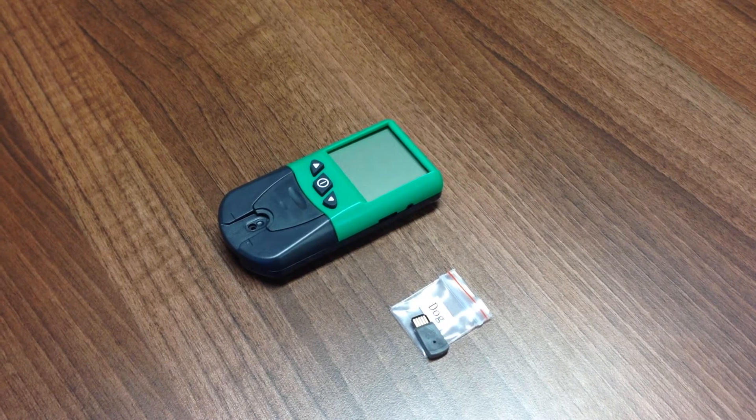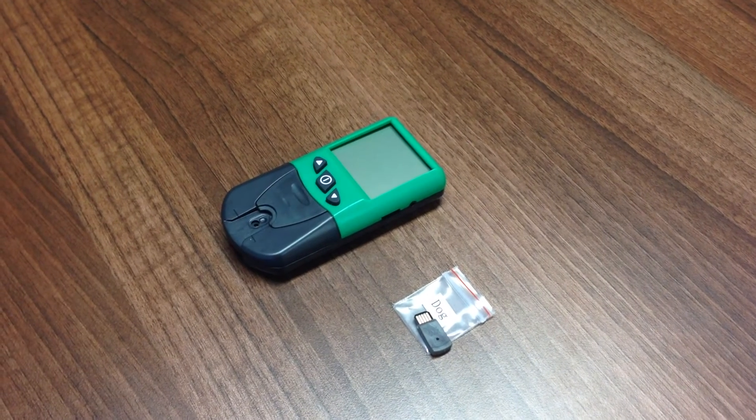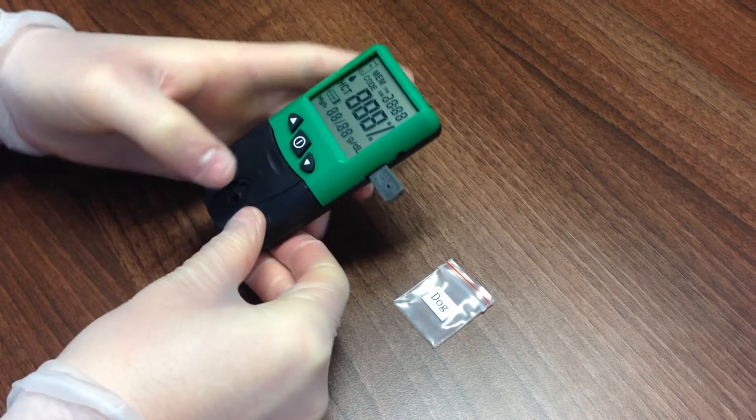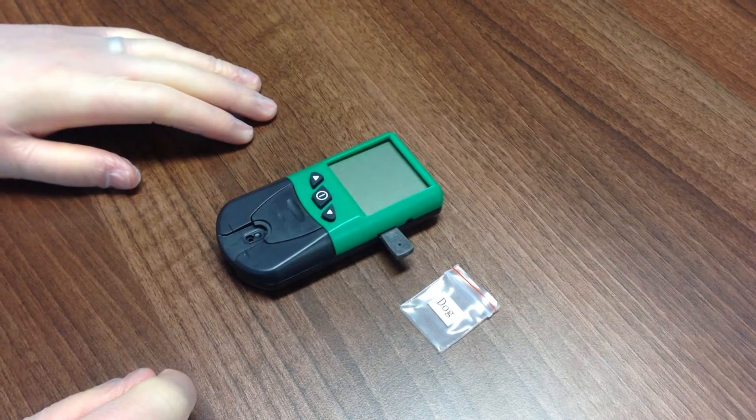To select the appropriate species, first ensure the meter is switched off using the power button if it's not already off. Turn the meter on with the power key. The code will be read automatically and displayed on screen — C for cat or D for dog. After reading the code, the meter will automatically turn off.